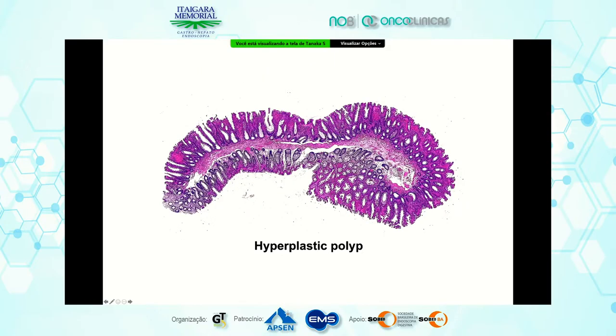So this is the histology of this lesion. This is a hyperplastic polyp. However, this lesion is accompanied by inflammation and a little desmoplasia in the mucosa.